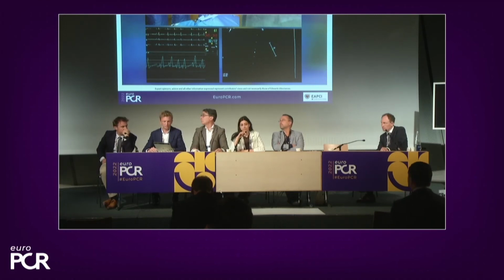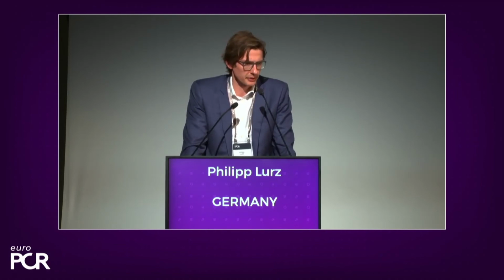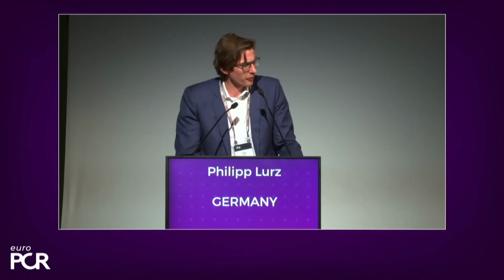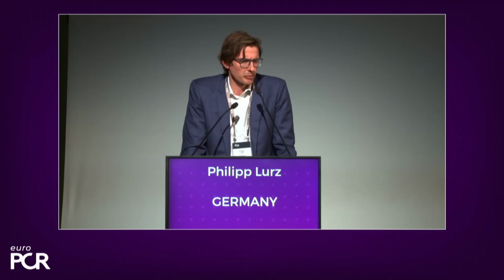The procedure is extremely safe. The complication rate is very low. When you look at the studies, obviously that includes a certain learning curve. There are some SLDAs, but there's no major complication. I don't think that in the studies there are any conversions to surgery reported, not that I'm aware of. And in general, it's an extremely safe procedure. Well, it's not so much about the complications, but it's really about obviously achieving an MR reduction as good as possible.